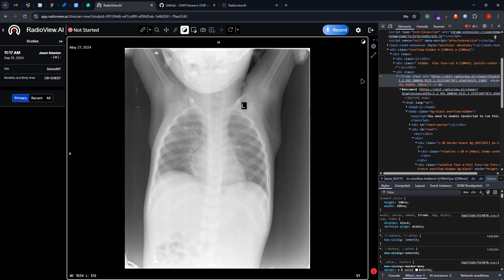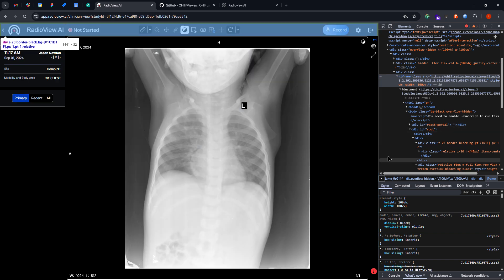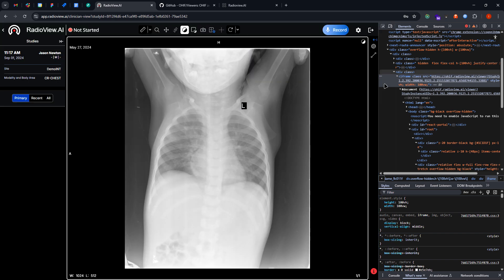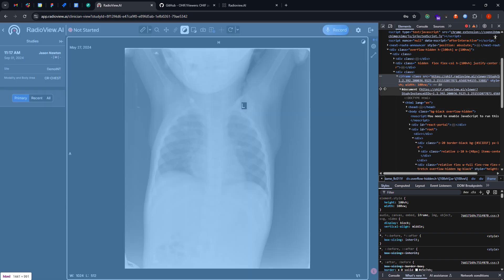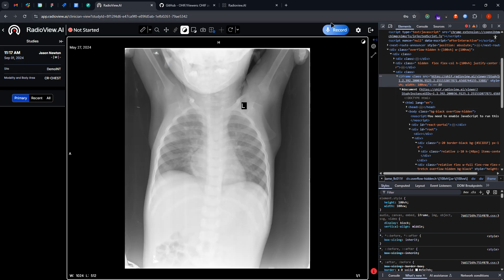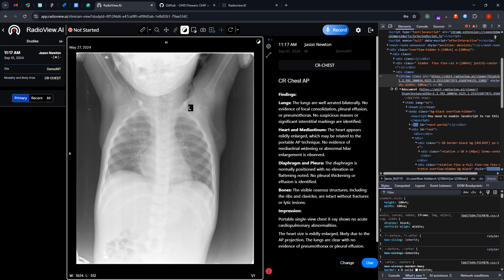So this iframe just interacts with our host application, and our host application has a feature called record here.